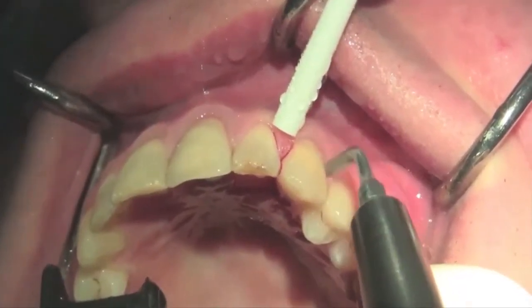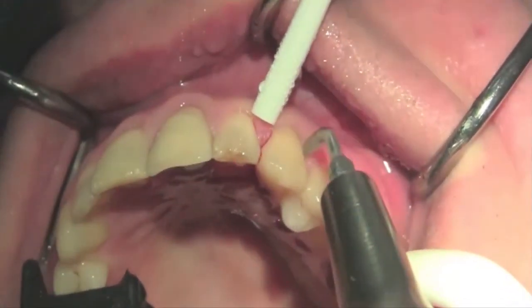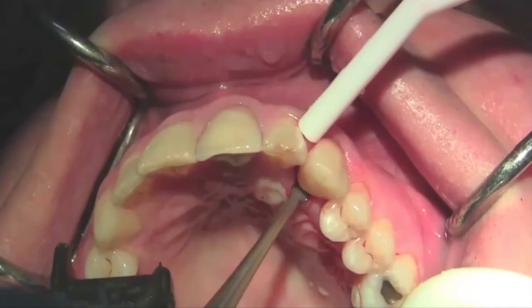So at this point, after you have been able to utilize the piezo tips, you have to be very careful as you are getting deep because you're going to be generating heat, and the irrigation is very limited as you get deeper. You don't want to cause necrosis of the bone because of overheating. So as you are penetrating, make sure that you apply very light pressure and that you allow the instrument to do the work.